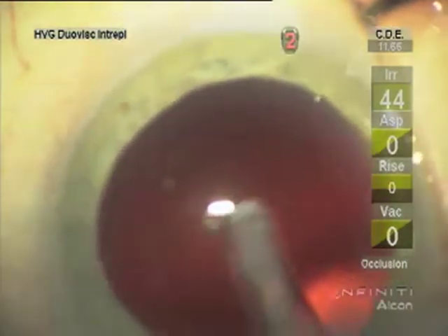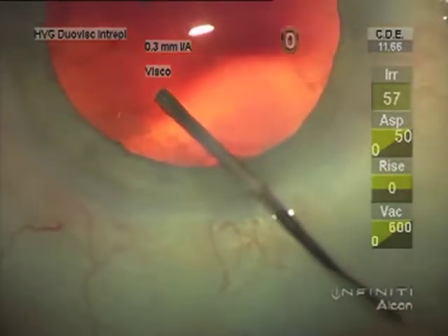For the polishing I use a very low vacuum of just a couple of millimeters and low flow, and even turn the vacuum off sometimes — it'll still maintain engagement of the posterior capsule for a very gentle scrub. I love this silicone IA tip.